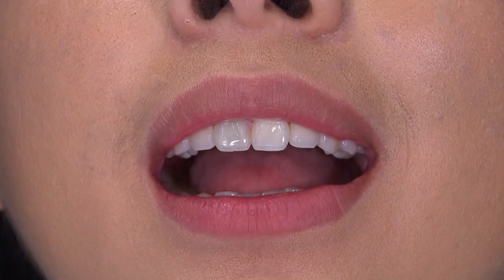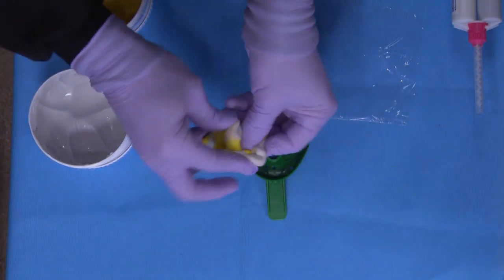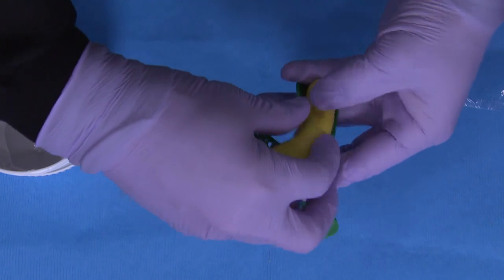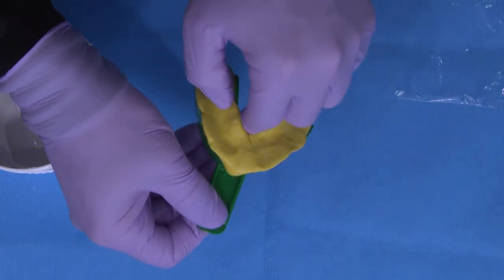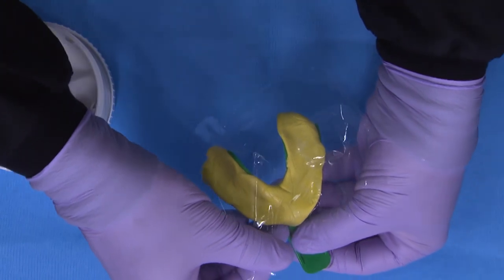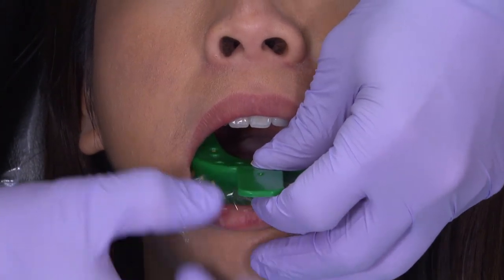It's also a good idea to make sure that the lips can fold pretty cleanly around the anterior portion of the tray after you put it in. Now starting with the lower tray, hand mix a pretty heaping spoonful of both the putty base and the catalyst in equal parts until that mixture is just one solid color. Roll the putty into a cylinder and shape it into that impression tray. Hand form a slight indentation where the teeth will rest. Put one of your pre-cut plastic squares centered on top of the tray, with the tongue cut area between the arches. Try to cover up all exposed impression putty with this plastic sheet.